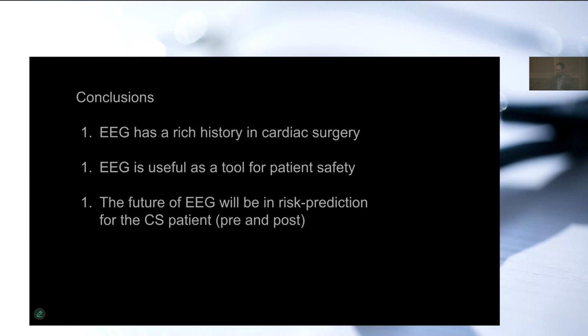I've actually done a pretty good job of trying to include papers that only have a standardized anesthetic that's reasonable. Sometimes you read the protocol and you're like, that's ridiculous. Like 140 of propofol for 6 hours, a ridiculous anesthetic, right? So I tried to include papers that actually only have reasonable anesthetics. But provided your typical anesthetic is reasonable, which knowing you, I know that to be true, then you see in your hands the breakdown of patients who are uniquely susceptible to burst suppression and those who are not, those who are robust to GABAergic drugs. So we still don't have a good way of distinguishing those who are just receiving maybe a slight overdose of drug and it's actually not declarative of a problem, versus those who will be at a durable and reproducible risk of postoperative delirium.